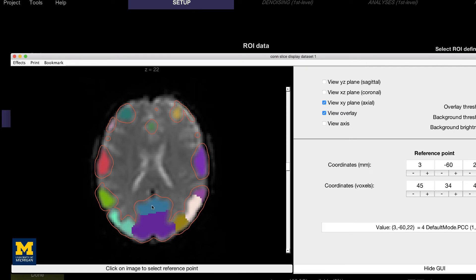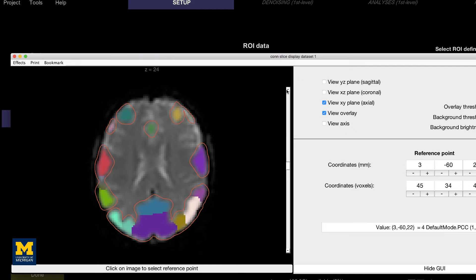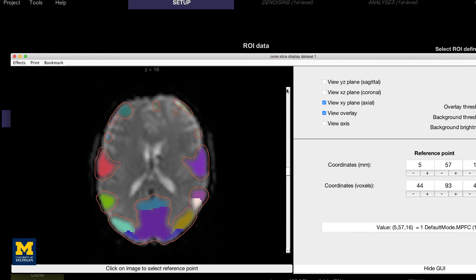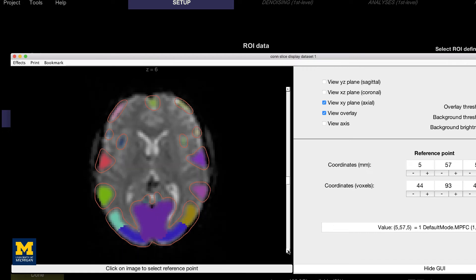If we click on, say, the blue area, this is one of the nodes of the default mode network, the posterior cingulate part of it. If we look at other slices, we can find other parts of the default mode network as well, for example within the medial prefrontal cortex.